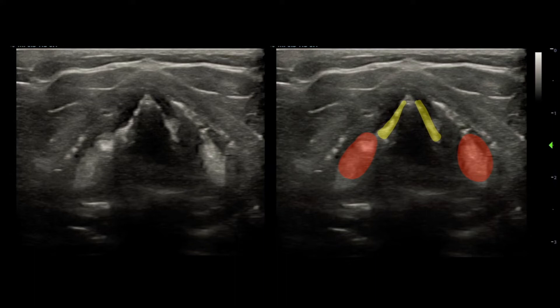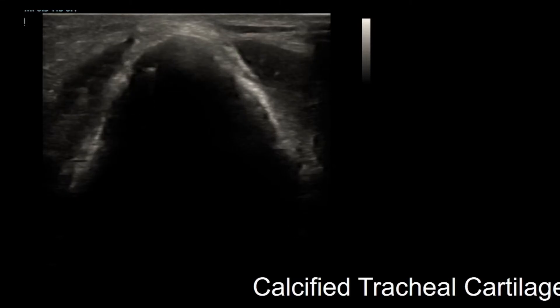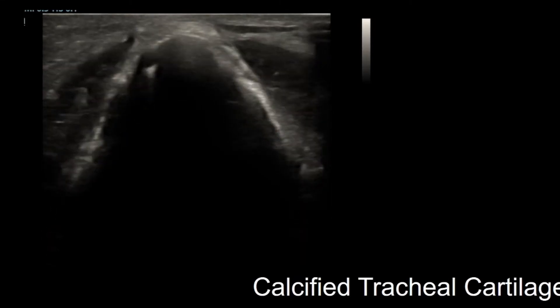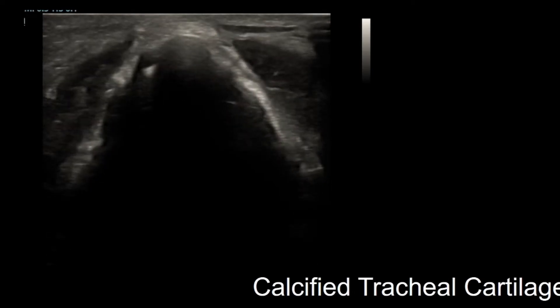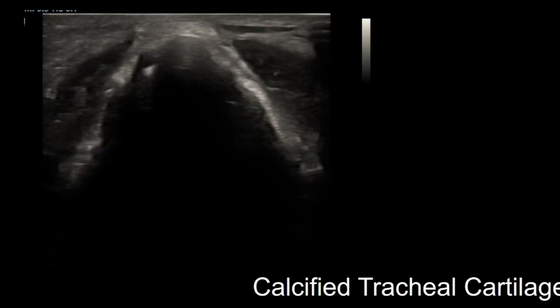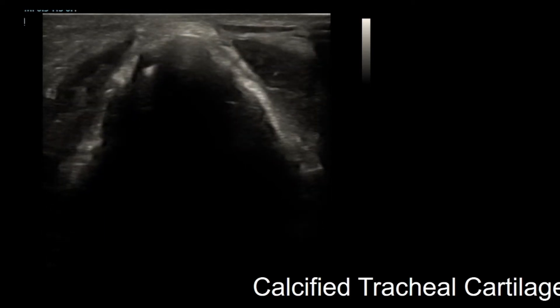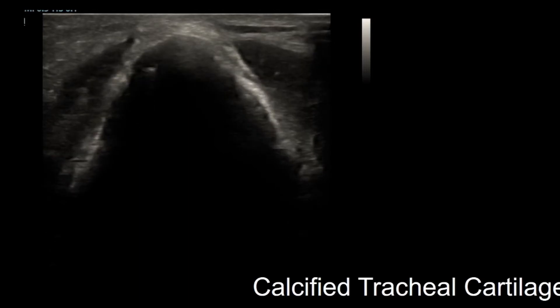Another view as you go a little more superiorly into the neck are going to be your false cords and your arytenoids. Another anatomical variant to be aware of is when you get older patients, sometimes you're going to get this view, because over time — later decades in life, 70s, 80s, 90s — the cartilage actually becomes calcified. Notice how in one view you can see the cords and the arytenoids in great detail, but when you have that calcification, you're just not going to see much of anything. So keep that in mind — as people get older, it might be a little more difficult.